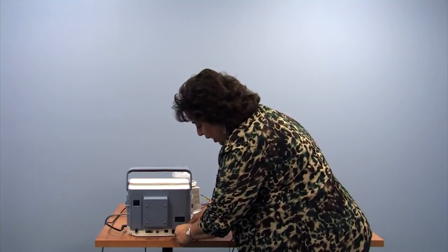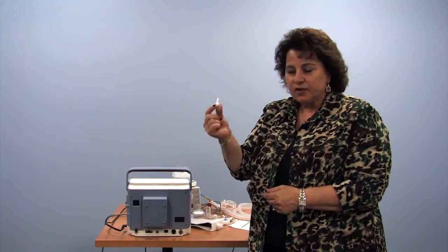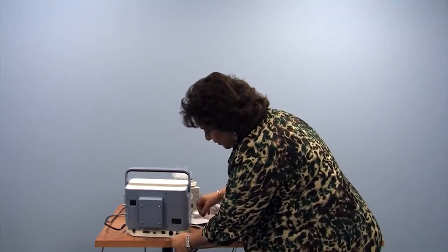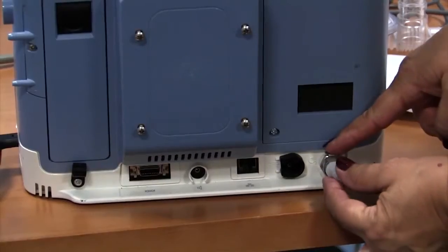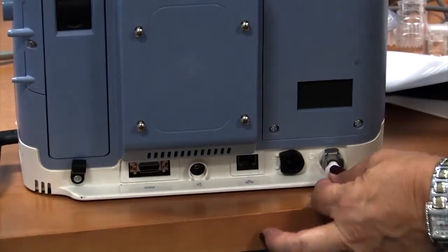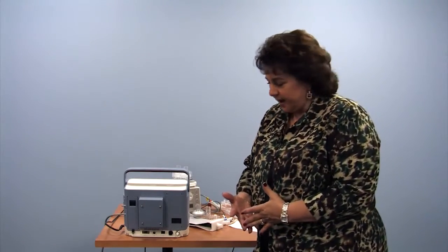Here we have a place for oxygen to be put into the device. So this disposable, potentially breakable piece should come with the machine and snaps into this port by pushing the lever on the top. If you want to remove it, you have to push to remove it. This is where oxygen tubing will go, that will go to your device that provides you with oxygen, whether it's a concentrator, a liquid system, or a gas tank.